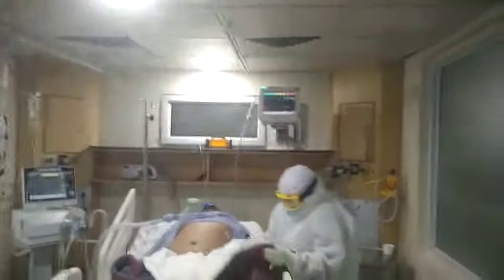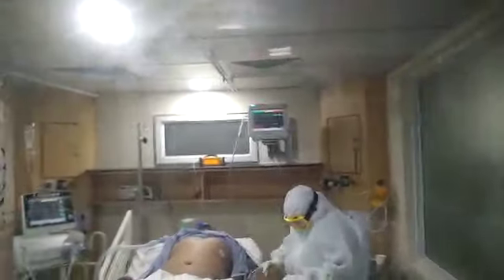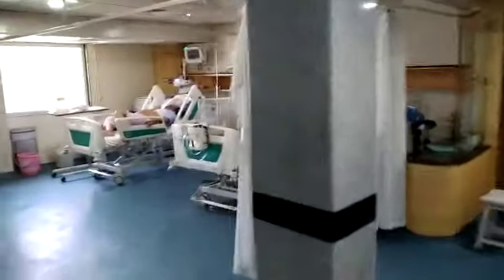इंट्यूबेशन सपोर्ट पे ये पेशेंट वेंटिलेशन सपोर्ट पे अभी हमने इनको इंट्यूबेट किया हुआ है. इनका बायलेटरल निमोनिया था. देन आई विल टेक यू टू अनदर पेशेंट. यहाँ पे 3 पेशेंट हैं. यहाँ पे 2 पेशेंट हैं हमारे पास.